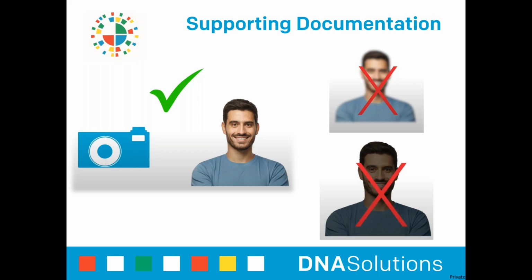Be sure to include all photos, IDs, and supporting documents outside of the sample envelopes. Please do not ever seal these items in a sample envelope along with the collected buccal swab.